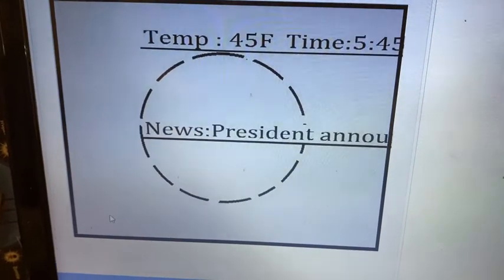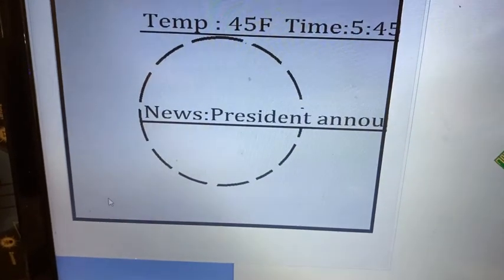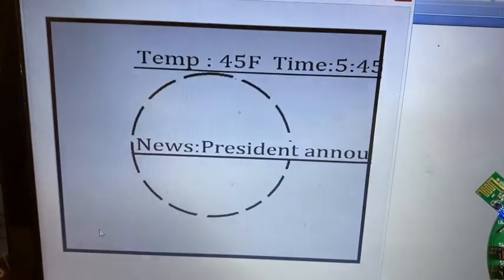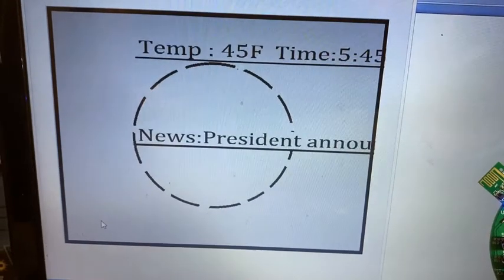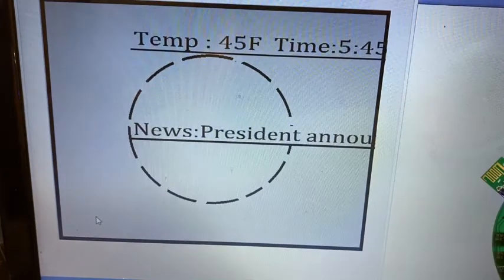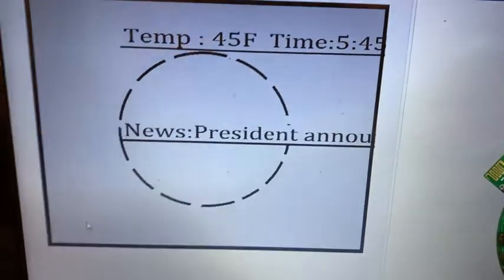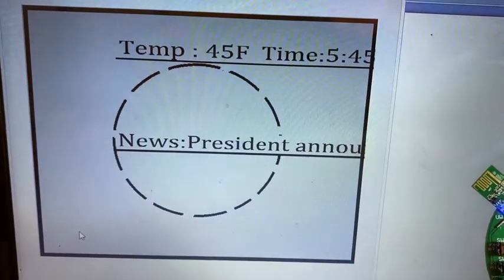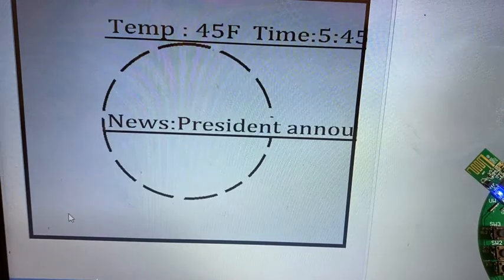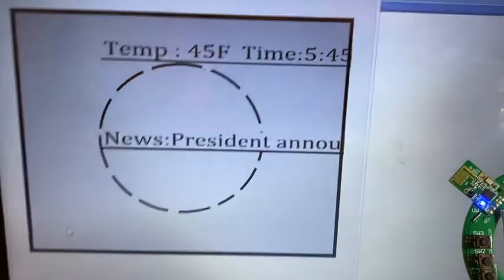Now, this is a fundamental technique, and technology that needs to be implemented in any future AR, VR enabled smart contact lens that will be utilizing not only the focused portion of human vision, but also peripheral vision, which is critical for most applications. In order for such technology to be useful and natural, the display that implements such capability will seem to be stationary relative to the eye, and will allow natural use of the contact lens and natural use of our eye.